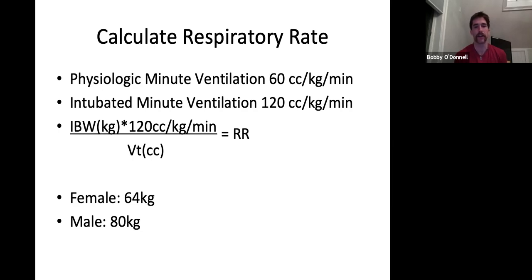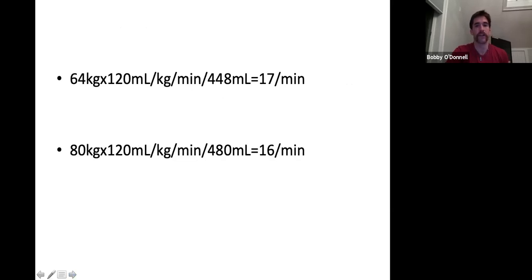Notoriously in the past, in an ED, someone wouldn't calculate vent settings. There'd be a tidal volume of 500, a respiratory rate of 12, and they'd be on AC, and that would be it. And that's really harmful to patients. That's why we're calculating our respiratory rate off of what the minute volume should be and what our tidal volume is based on ideal body weight. So that's done.